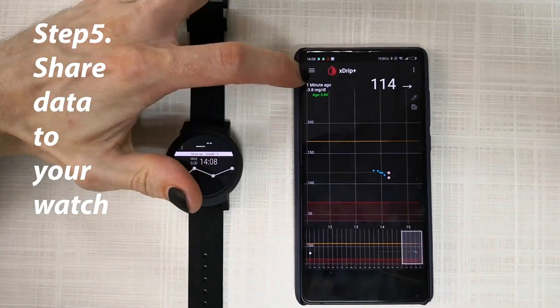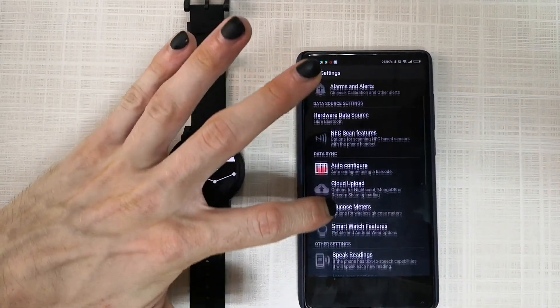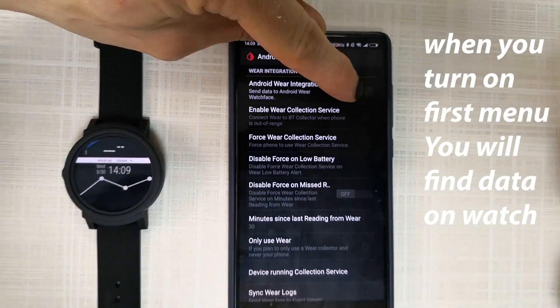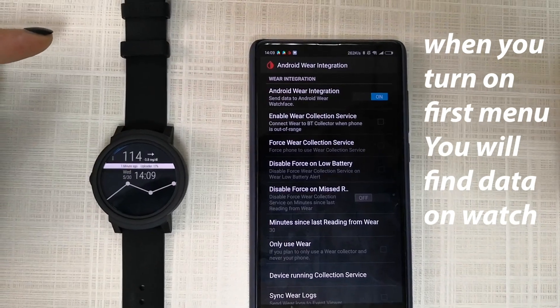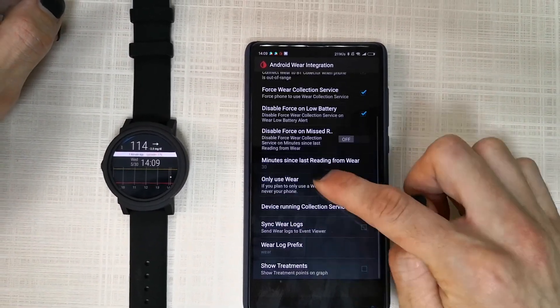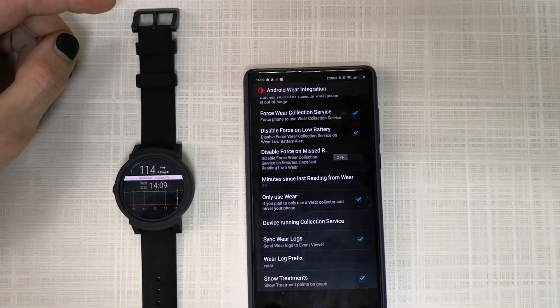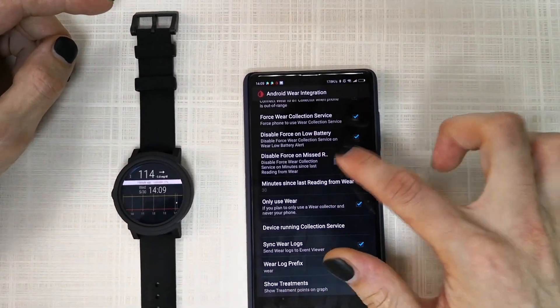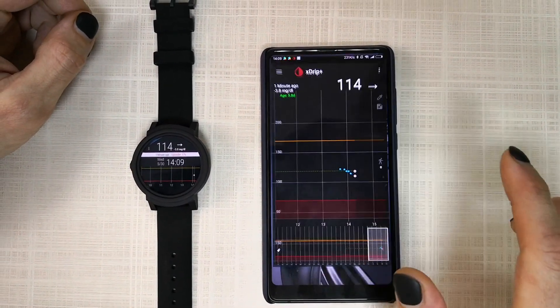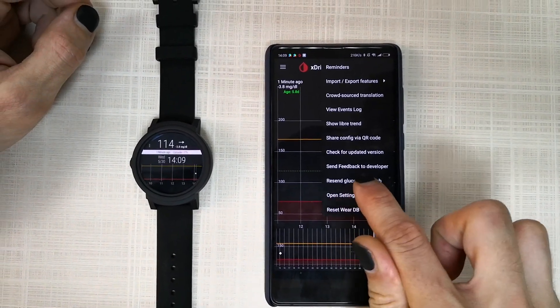After you calibrate, go into the menu, go to Settings, then Use your Smartwatch, then Android Wear. Press on and check all the checkboxes here. After that you will see the option 'send glucose to watch' — press it.